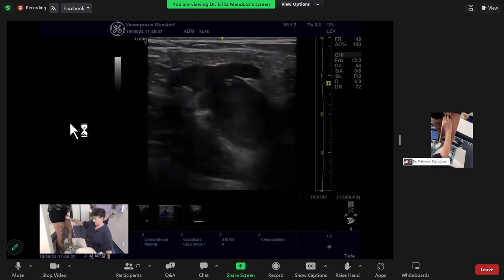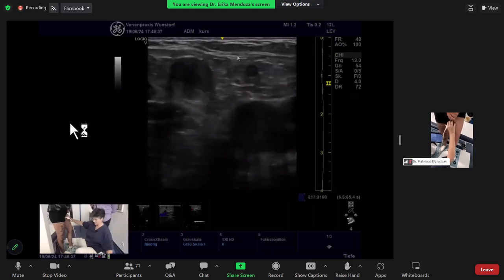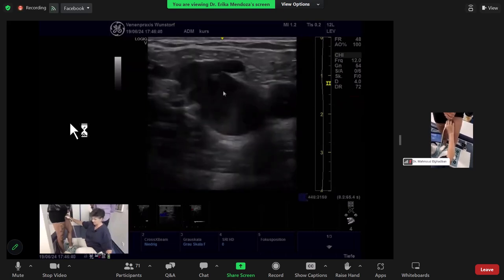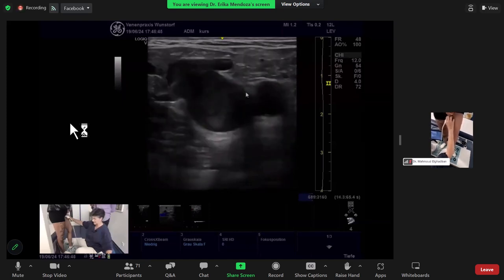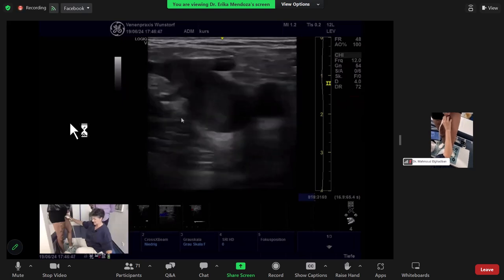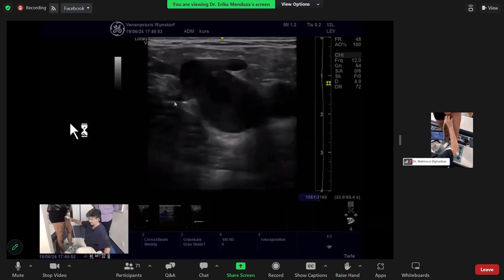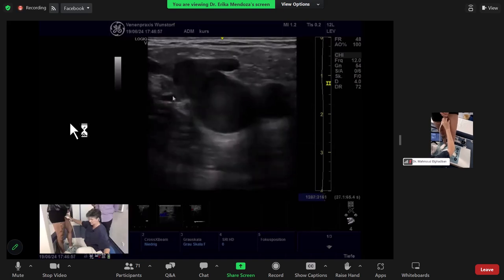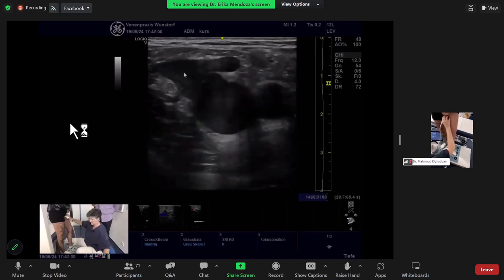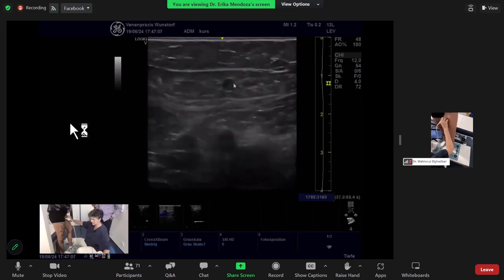Yes, this is the left groin. And on this side, the lady has an accessory anterior vein. If you remember, on the other side, we had none. We come back from the beginning. This one is the artery. This one is the common femoral vein. And you have lots of fantastic veins here. You have the pudendal going straight into the junction here. So this is the saphenofemoral junction. Here you have a common trunk for the accessory anterior, which is going down here.